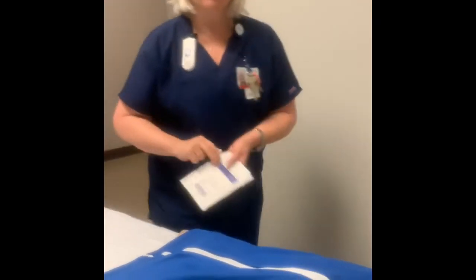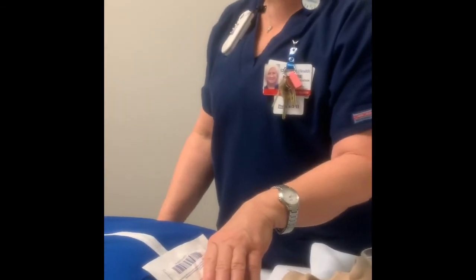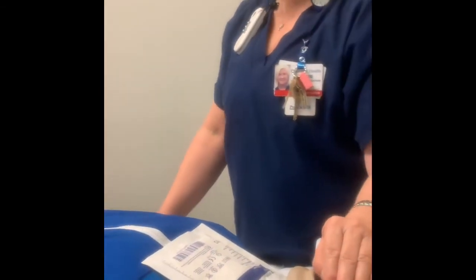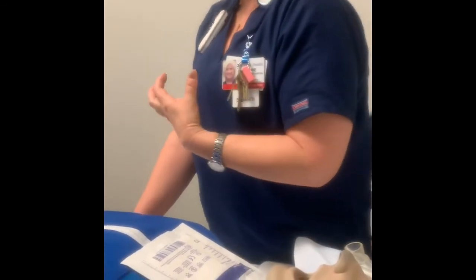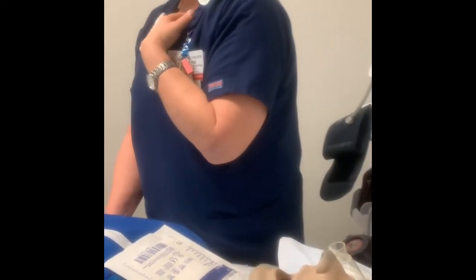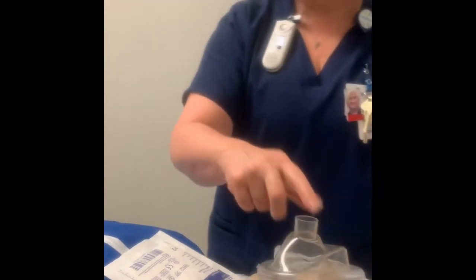So the one thing you want to do is get a 4x4. You can cover it here. Okay, you want to cover it here. Then you can ventilate them here. Okay, so we just have a regular tracheostomy tube. The larynx is intact. It falls out. Just cover it with a 4x4 and ventilate them here. That's all you need to do.